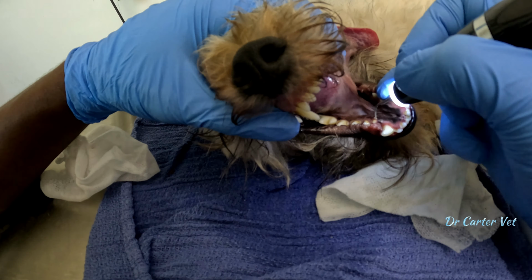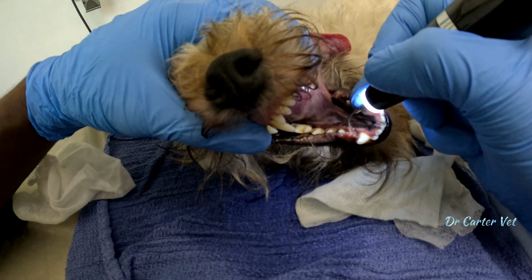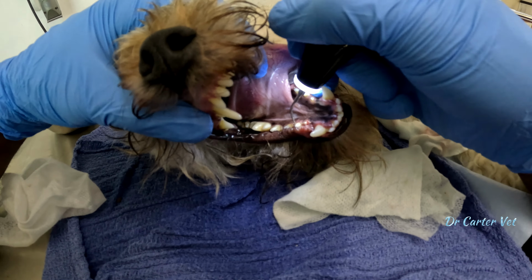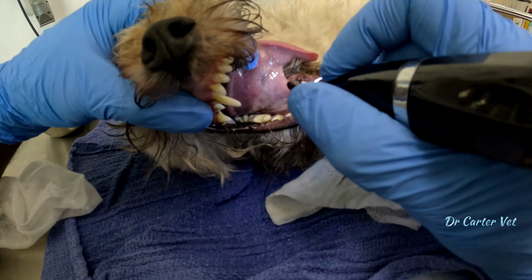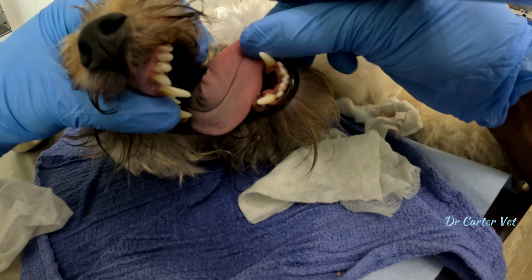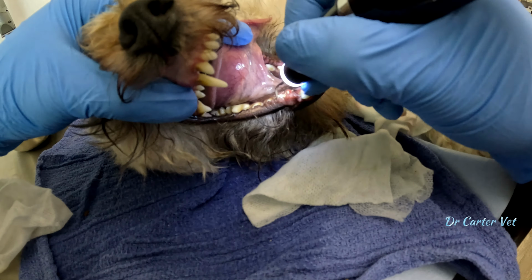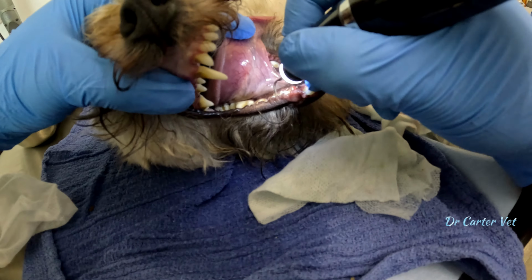Cleaning on the inside is a bit more technical. Of course, with all this maneuvering, the gum sometimes bleeds. The tongue can also get in the way. This ultrasonic scaler that I'm using does not activate on soft tissue, it only activates on hard surfaces. If it's not on the teeth, it would not work.